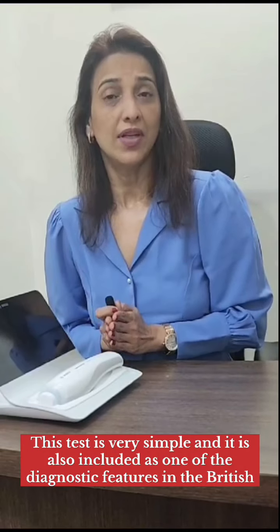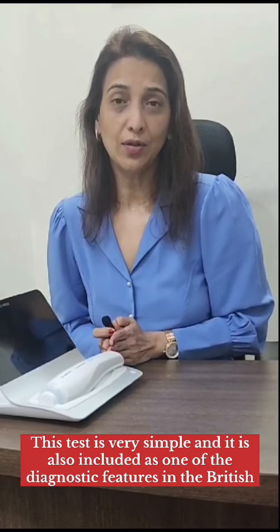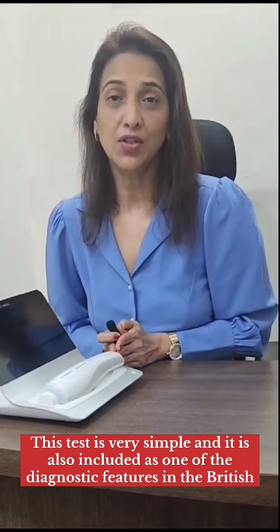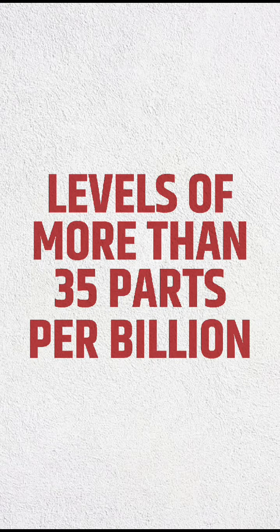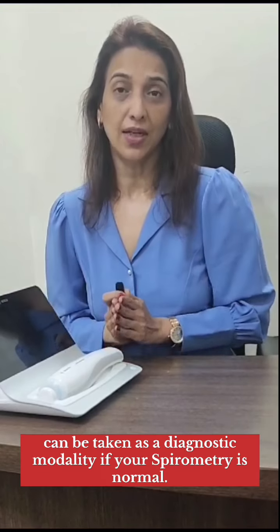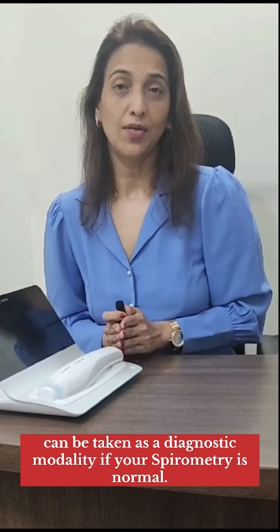This test is very simple and it is also included as one of the diagnostic features in the British Thoracic Society and the newer NICE guidelines, where levels of more than 35 parts per billion can be taken as a diagnostic modality if your spirometries are normal.